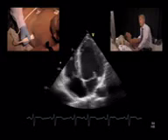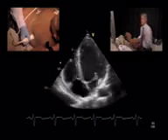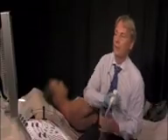The left ventricular ejection fraction was calculated at 67 to 72%. So altogether we have signs of volume overload. And this, together with the color Doppler and the continuous wave Doppler, will then lead us to the diagnosis or to the severity of aortic regurgitation.